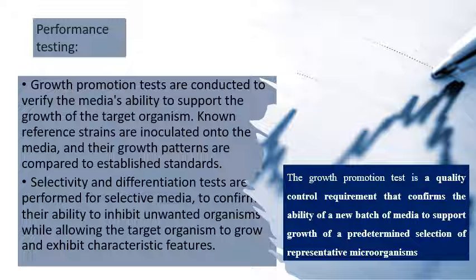Then, the performance testing. Evaluation of media suitability for target organism cultivation is achieved through growth promotion testing. These assessments involve inoculation of an established reference strain. We have different reference strains, we have ATCC, we have MTCC, and so on, onto the test media, followed by strict comparison of their growth pattern against a well-defined benchmark of microbial growth of the same species.